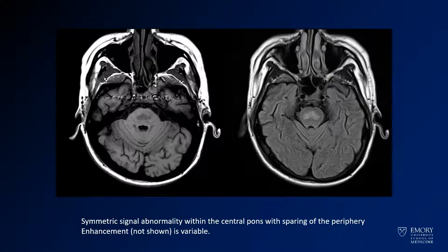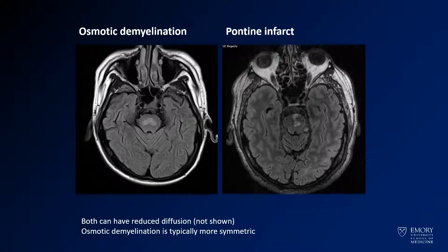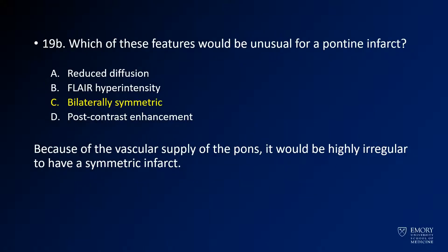Sparing of the periphery is pretty common. For comparison, the osmotic demyelination case is on the left and a pontine infarct is on the right. The osmotic demyelination case is very symmetric across the midline, whereas the pontine infarct is confined mostly to the left side. Pontine infarcts do not usually occur in a bilaterally symmetric fashion — the vascular supply of the pons makes that very unusual. So if you see a bilateral symmetric abnormality, you should be thinking more about metabolic abnormalities.